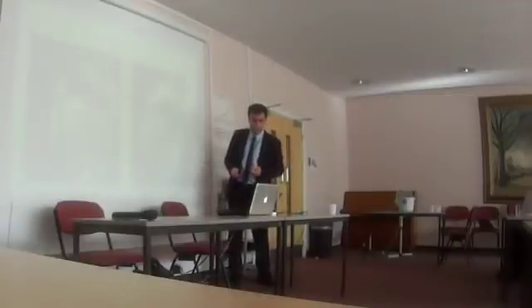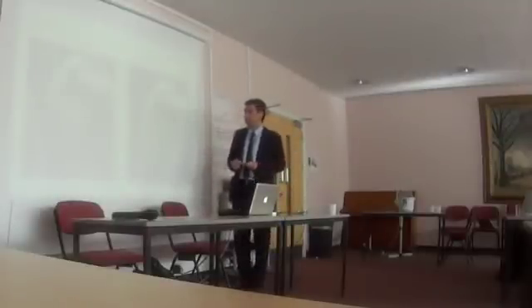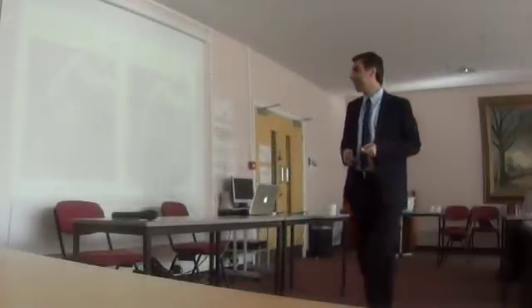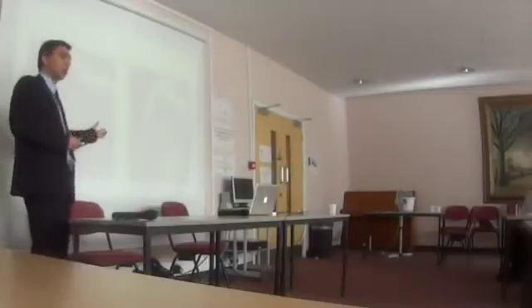When we apply the scar study, these are other images, just a movie. When we apply the gadolinium enhancement, unfortunately, it becomes brighter and brighter by the minute. If you look again, just try to remember this is the heart muscle, the black, and the white is the scar. The amount of the scar is more than the muscle. So his heart is completely scarred. He's very young considering his amount of scar. If you remember all the other pictures I showed you, there is more white than black.